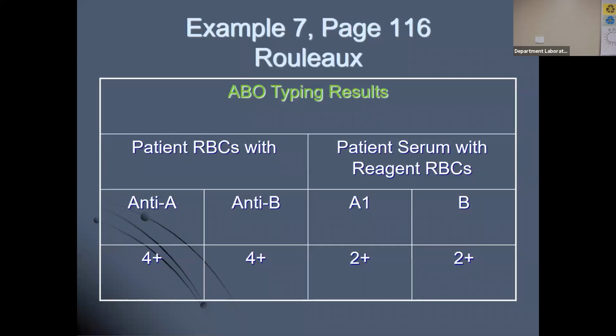You'll still have to perform the saline replacement. Make sure these reactions go negative, then you can report out your type. So actually, you guys will have to do a type and screen if you have a patient that's in the hospital and they're consistently getting products or being treated. They have to have a new typing screen done every 3 days, every 72 hours.